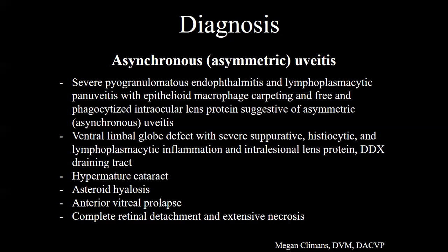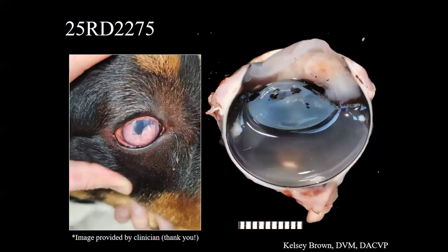Yeah, especially since it doesn't happen with normal lenses. And it doesn't happen with cataract. When you already have liquefaction with the lens matrix, it should leak out then too. So this is a different process. So I agree with Dr. B. Okay. The other.